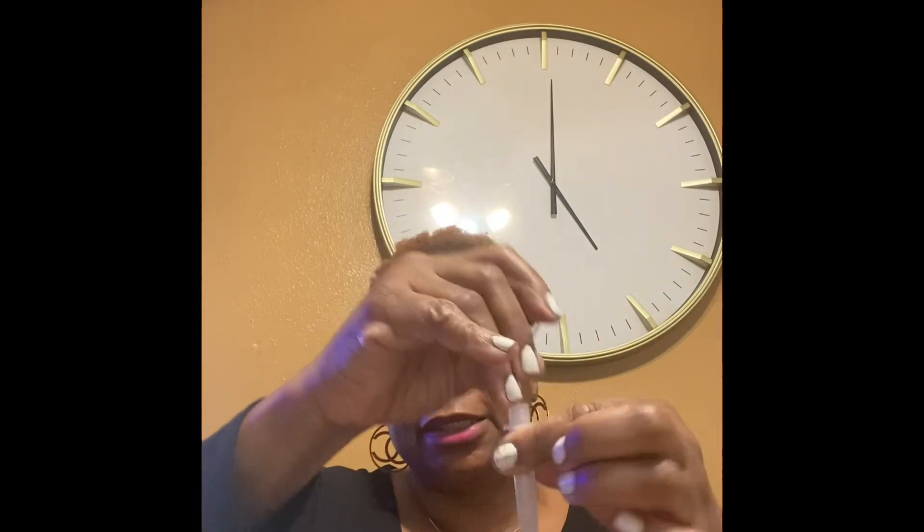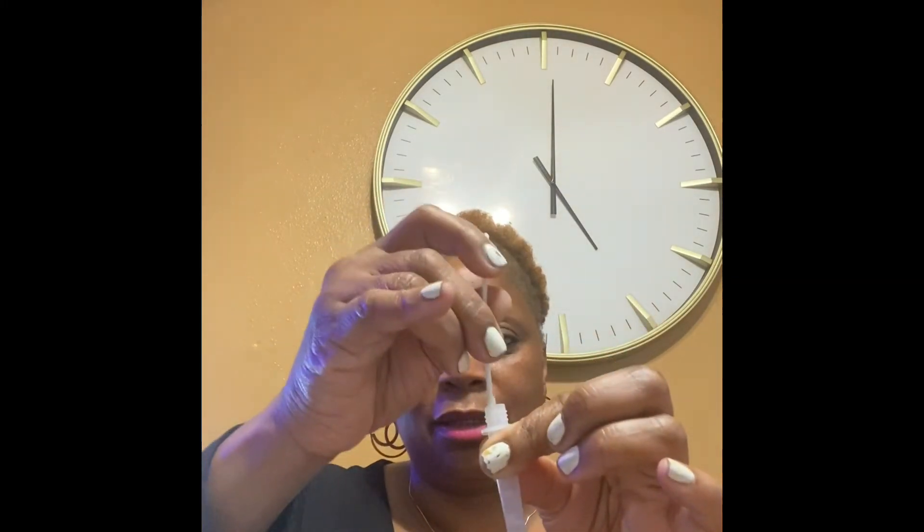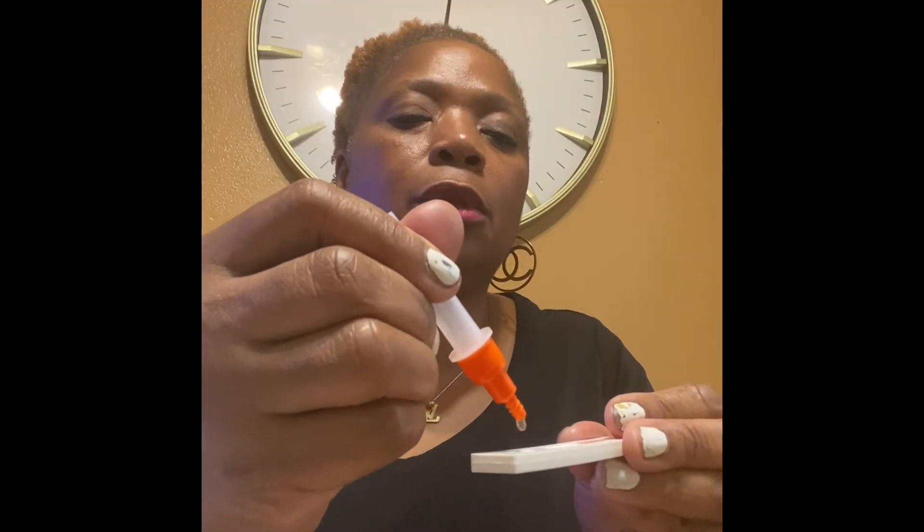That should be good. Just try to squeeze against the side to make sure you get all of the solution. You should take the swab and go ahead and dispose of it — I just stick it back in here so I can dispose of it. And I put the top back on it. Then you're going to take your test card and it says to put three drops in it: one drop, two drops, three drops.